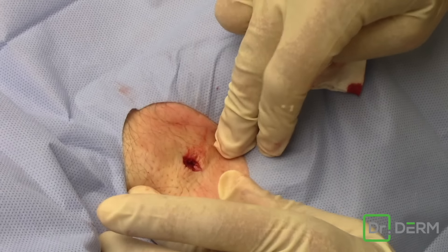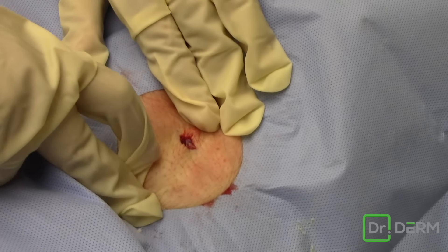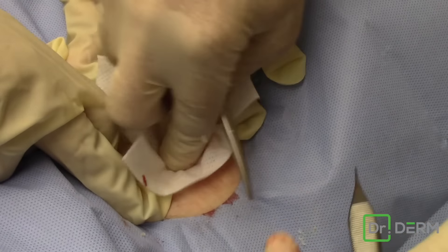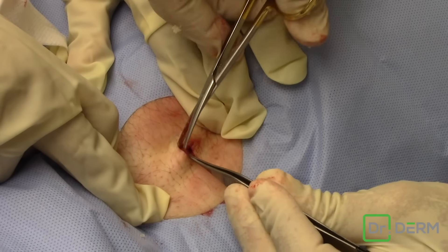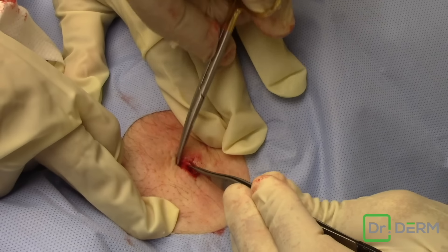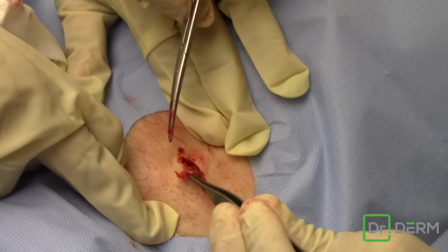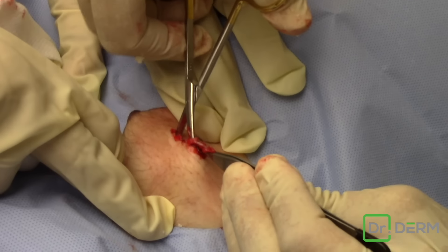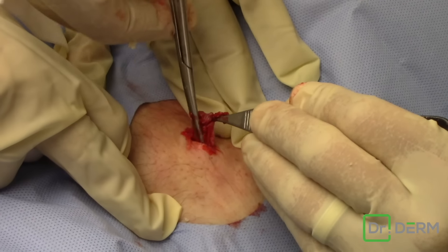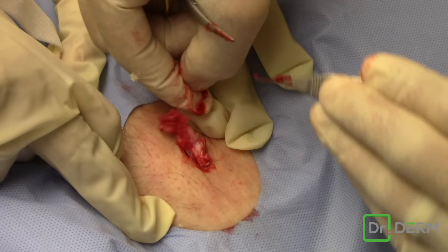There we go. I can still see it. So why don't you stretch that out right there. Get a little bit of that. See if you can kind of see the cyst lining right there. Okay, relax a little bit. Wow, look at that.